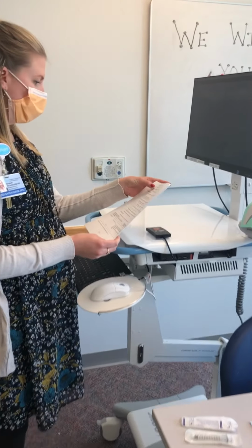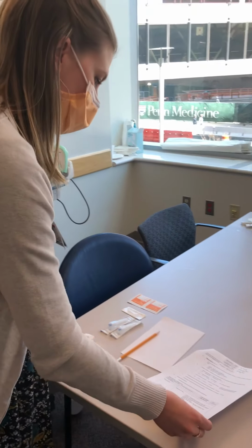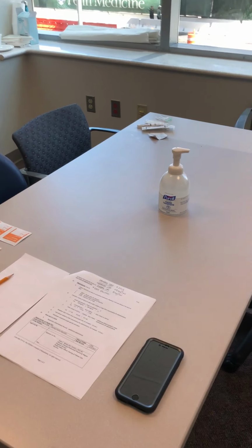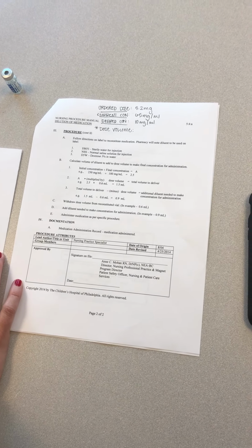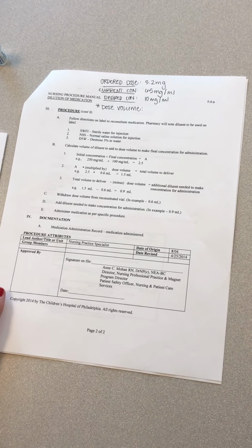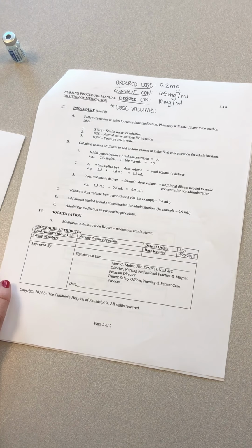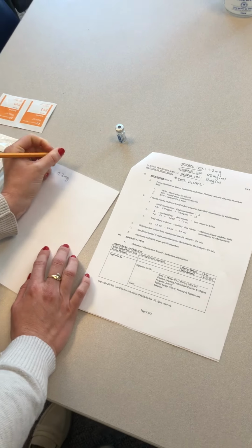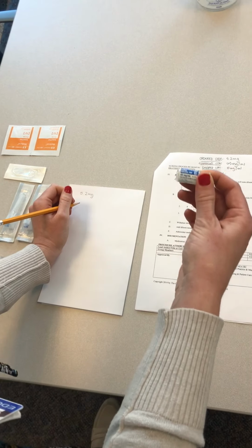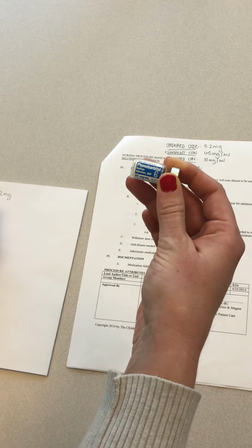So I just checked my dose volume against my order in Epic, and now I'm going to start working through the procedure. My ordered dose I just checked was 5.2 milligrams. I'm going to come up with the dose volume, which is available to you in your MAR, but you should double check it on your own. So my dose is 5.2 milligrams, and our concentration comes from the Phenobarb vial. It's 65 milligrams to 1 ml.